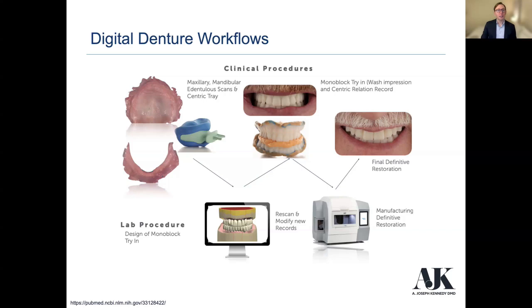Then you either have a centric tray or some way to capture the centric relation, right? So that's visit one. Then you can go ahead and design it. The lab can design it for you, or if you have design software like Exocad in your office, you can design it there. Then you can print, which is the nice thing, a resin mock-up.